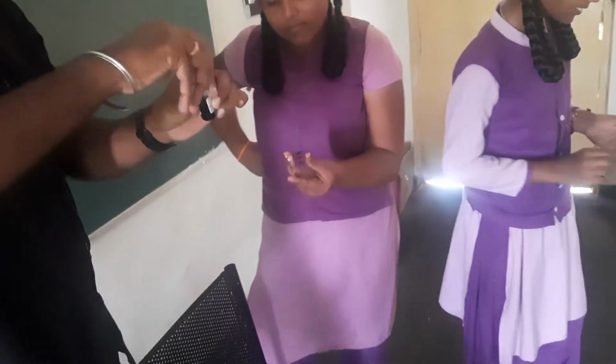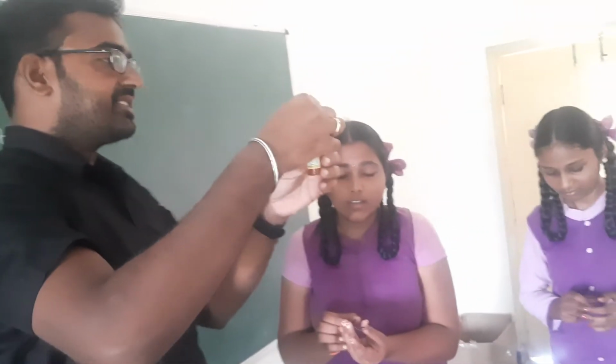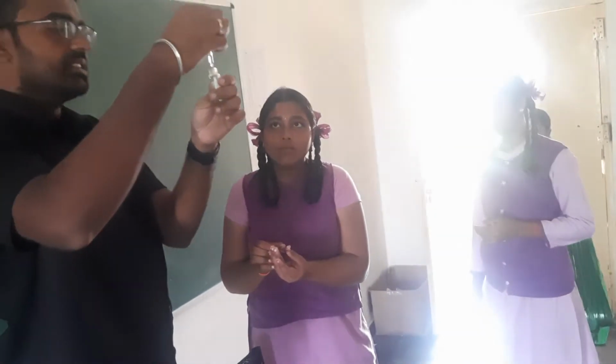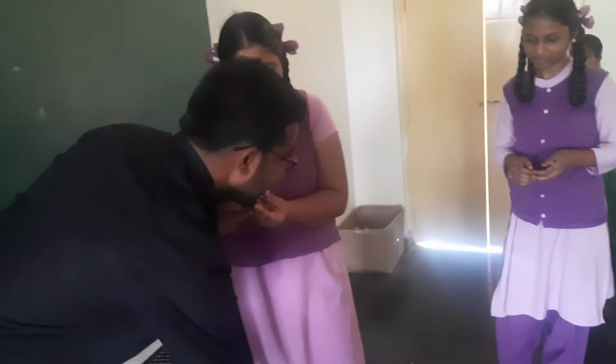Then anti-B sera into the next circle, the B circle, and then anti-D sera into the RH circle.